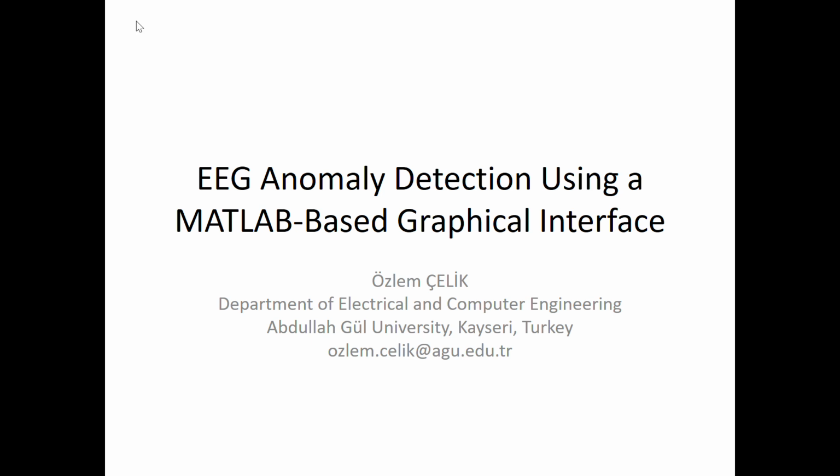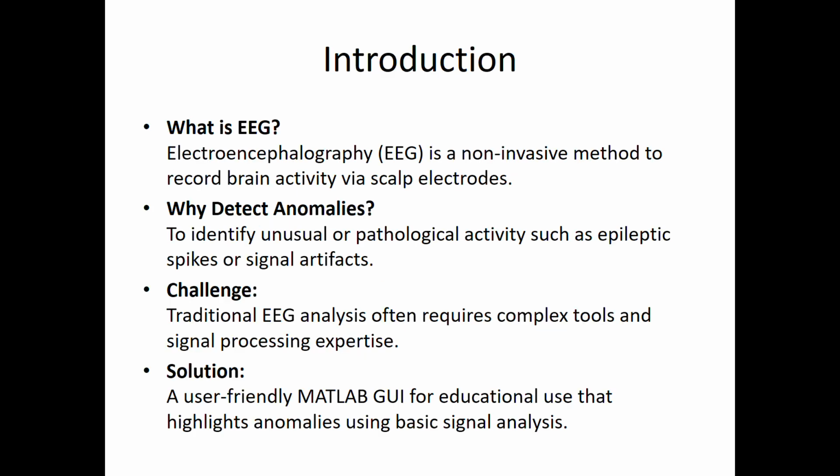Hello everyone, my name is Özlem and I'm presenting my project titled EEG Anomaly Detection using a MATLAB-based graphical interface. This project focuses on identifying irregular patterns in brain signals, particularly using EEG (electroencephalography) data through a simple, user-friendly tool developed in MATLAB. We begin with a quick overview of what EEG is.